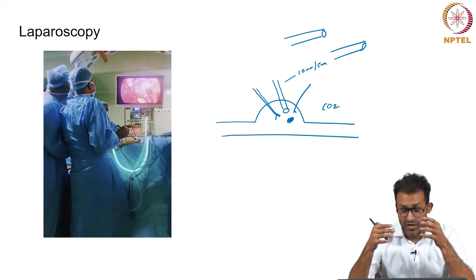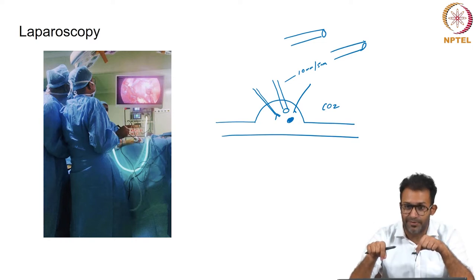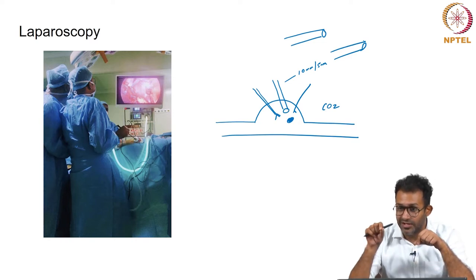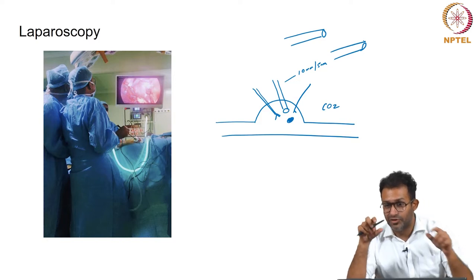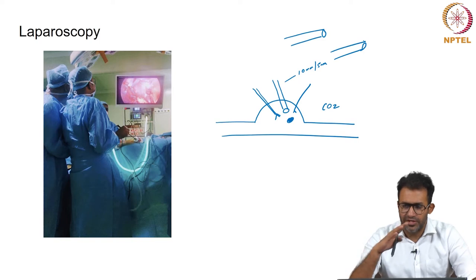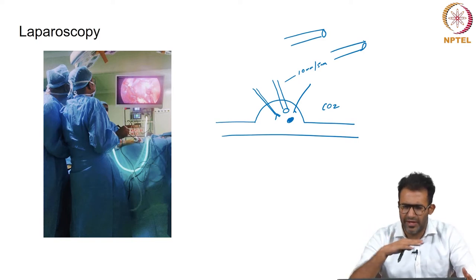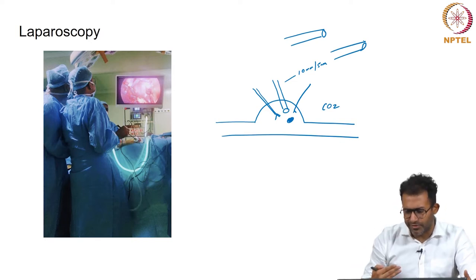These days we are using laparoscopic ultrasound as well, putting an ultrasound device through the laparoscope and trying to visualize certain cancers which cannot be visualized through CT or MRI or traditional ultrasound. So the potential for laparoscopy is immense, and right now we are doing a lot of stuff through laparoscopy. It requires a huge amount of skill and dedication on the part of the learner to improve his skills in laparoscopy.